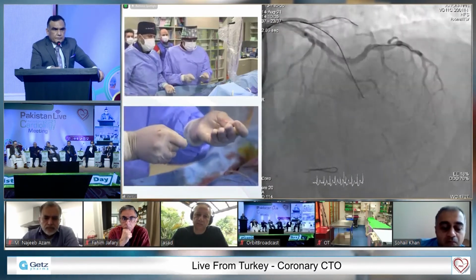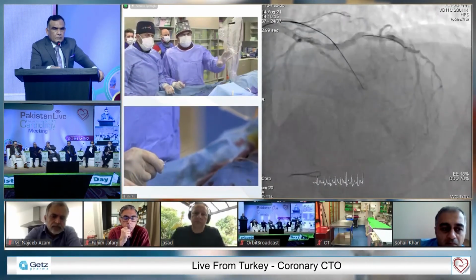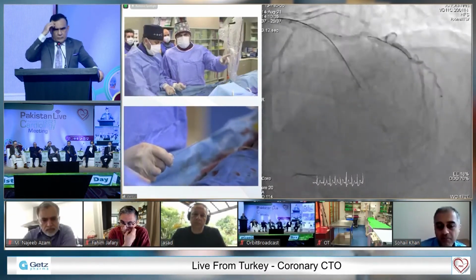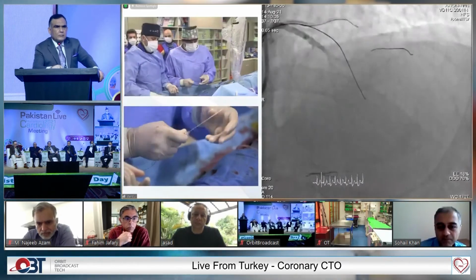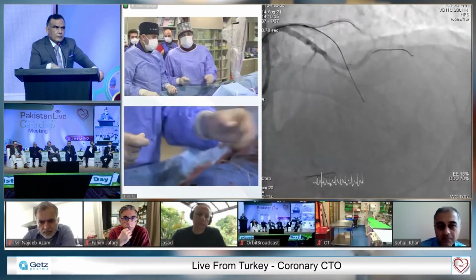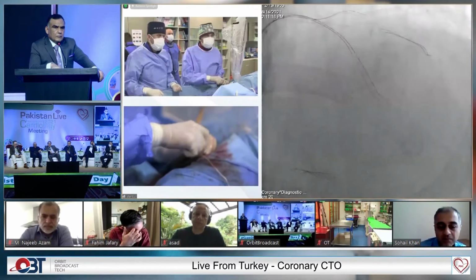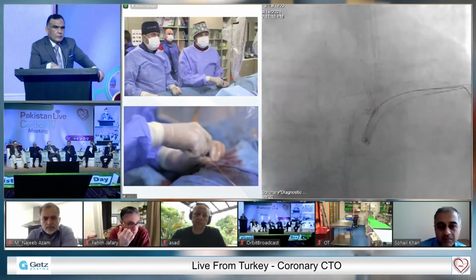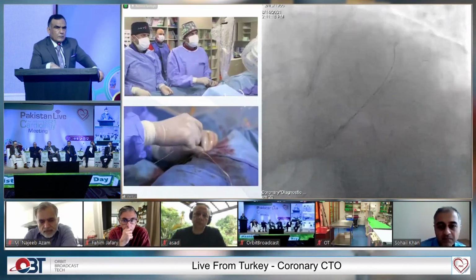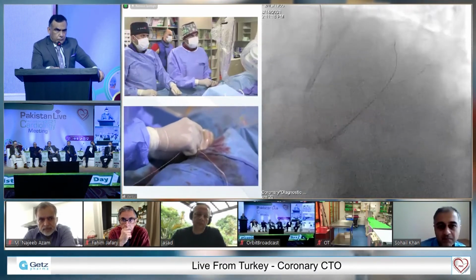I think, guys, I lost in that area, right? Many places I couldn't find the distal. From now, if I do work there, it's to me a waste of time. So it's obvious, not easy to form distal, even with parallel wire. It's a long lesion. I don't want to do the parallel wire technique here, and it's a long CTO. Let's do it here, because it will be shorter than trying more antegrade.